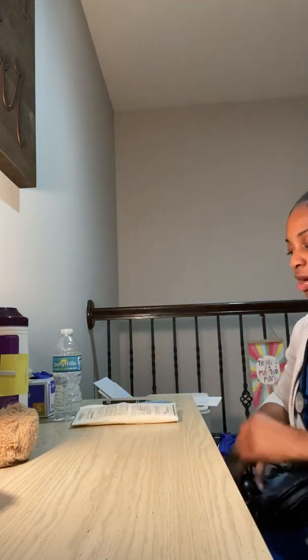Before suctioning, I'm gonna always perform a respiratory assessment, which I've done previously. I'm checking for any chest retractions, nasal flaring. I'm gonna perform lung sounds, which I've done already, and she's got some rhonchi with copious secretions. So I'm gonna be suctioning. And she's also on 30% FiO2, so I know that I'm gonna need to hyperoxygenate my patient prior to starting.